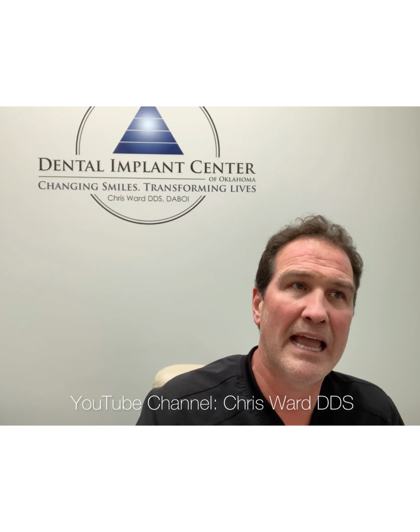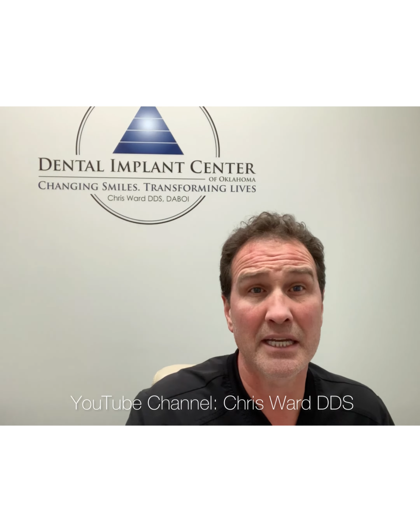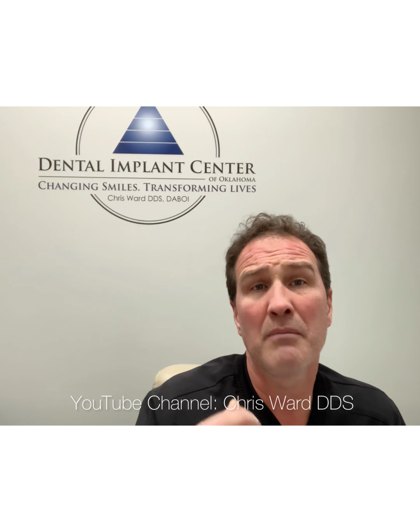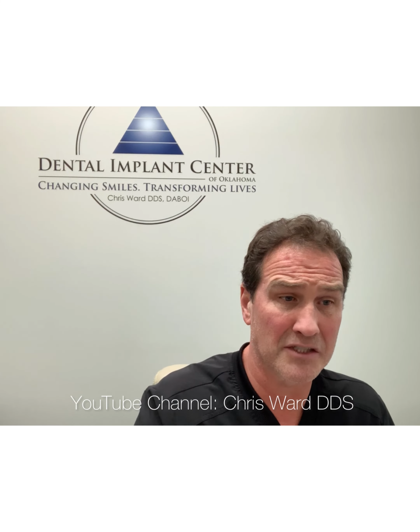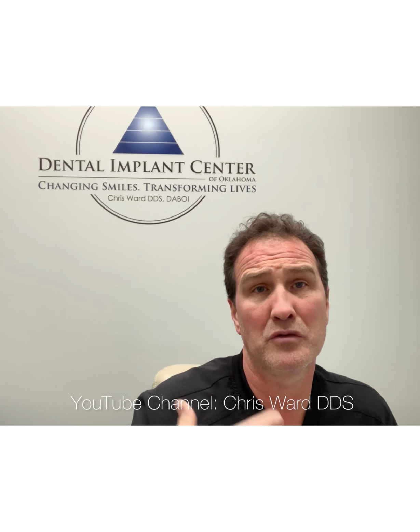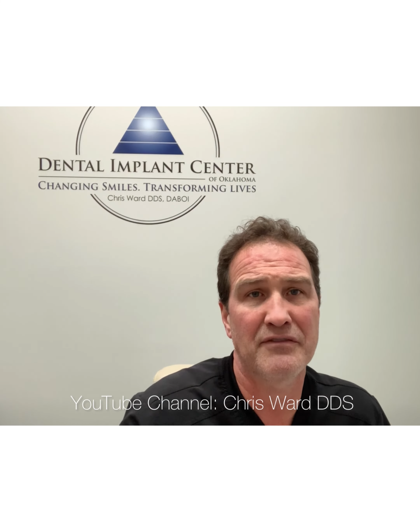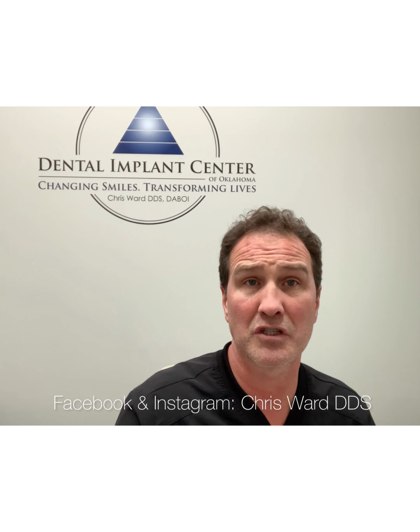Then you start looking at more complex type dental implants, whether it's the zygoma implant or the pterygoid implant. Those implants are used for the upper jaw, and it's a situation where the upper jaw is pretty much non-existent. Where the bone used to be that held the teeth in place, that bone's gone. And so now we have to figure out what can we anchor the teeth to that gives us a chance for you to chew and function normally.